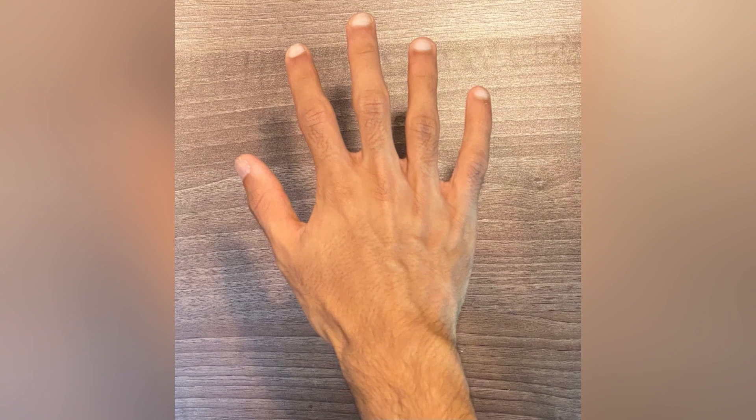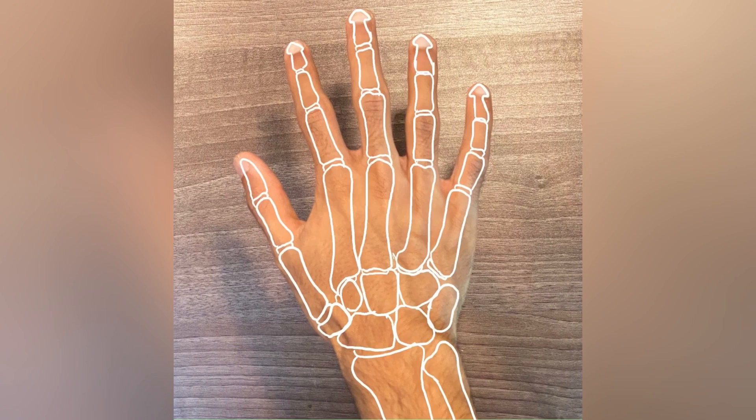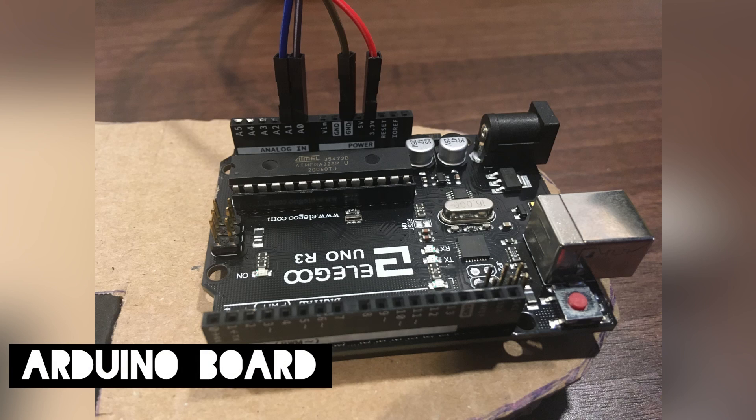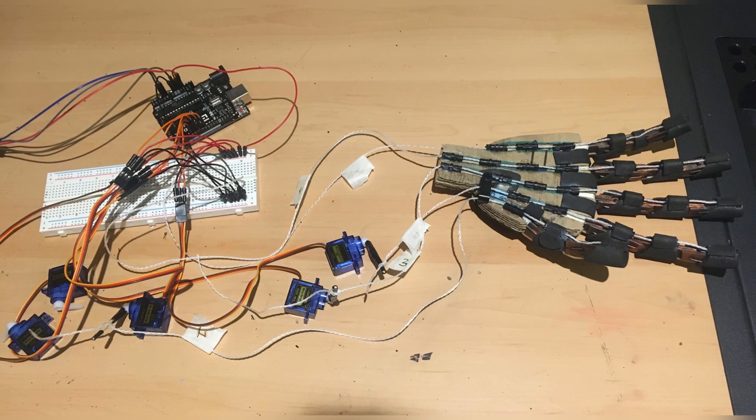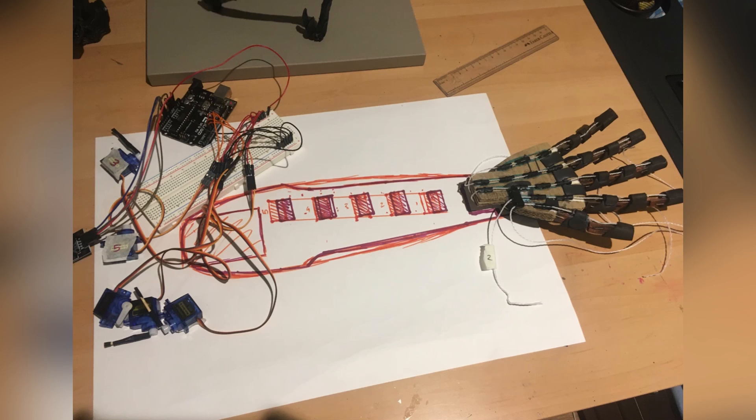I based the form of the bionic arm off the biological design of a human hand. I had to self-learn several skills in order to make the arm work. These involved learning the Arduino programming language, coding and building the electronic circuits using an Arduino board, and building moving parts that interacted with the electronic components. For this first version, I built a bionic arm predominantly out of cardboard, and the fingers are made from ice lolly sticks which I layered together.